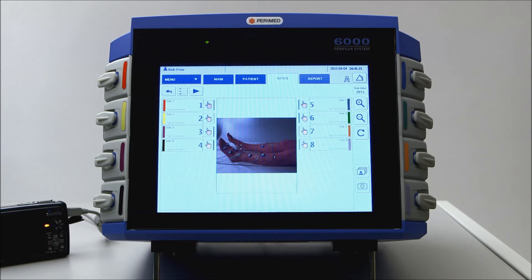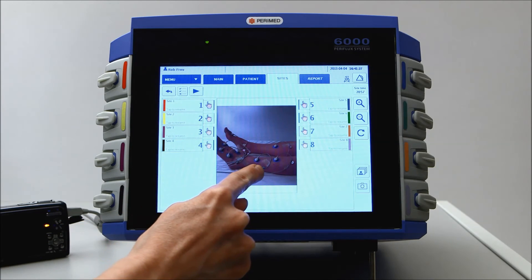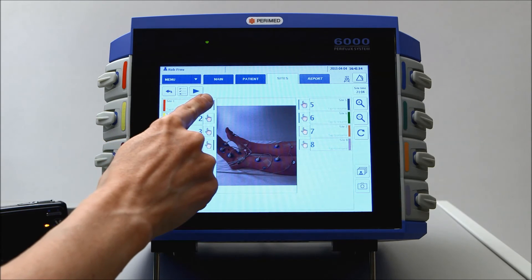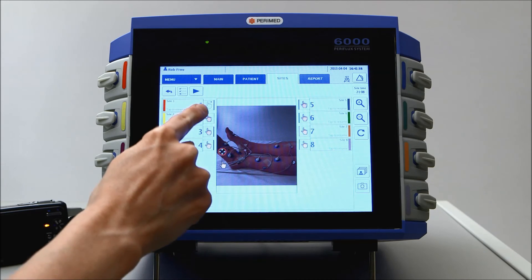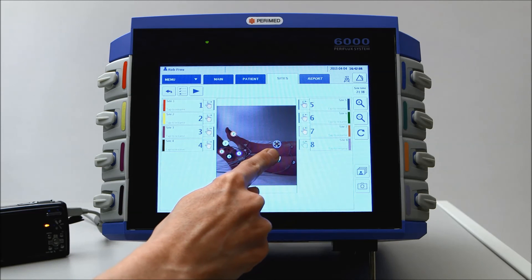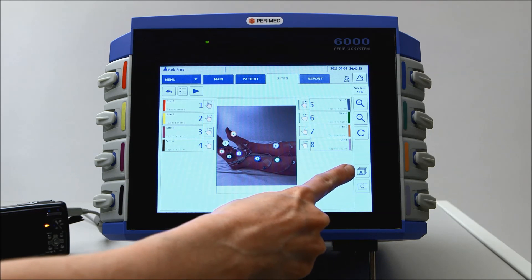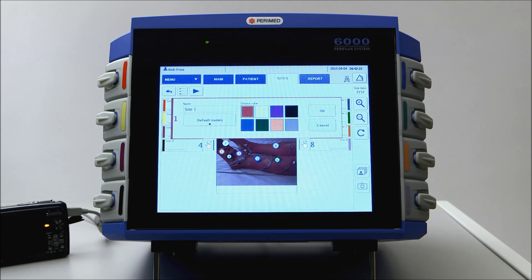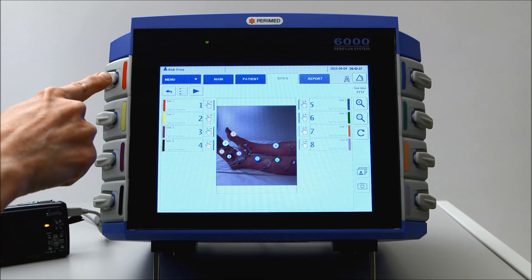You may zoom by clicking on the plus and minus symbols, or rotate the image with the arrow. Indicate the sites by tapping and dragging the target icon over each electrode. If you're not able to take a photo, select an illustration from the library. Give each channel a name by either using the defaults or entering free text. Make sure that the colour coding is correct.